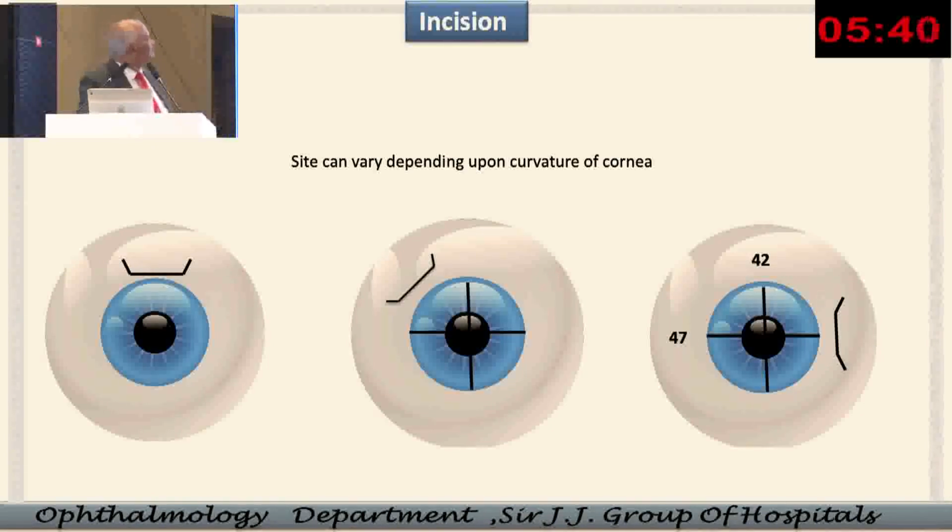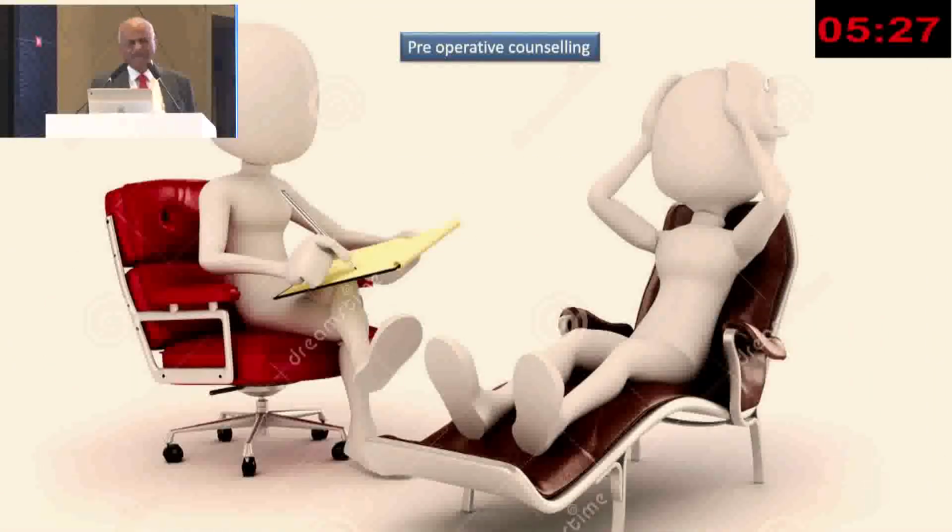Now the site, it depends on the sites also. Whenever you are taking the incision, you must know the curvature, and according to the curvature you must slightly change this. And the second thing is pre-operative counseling.